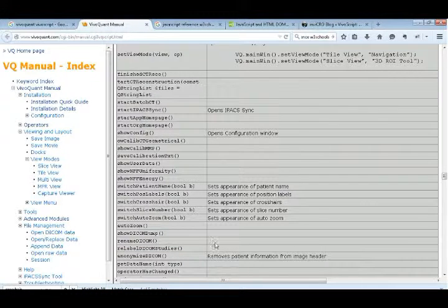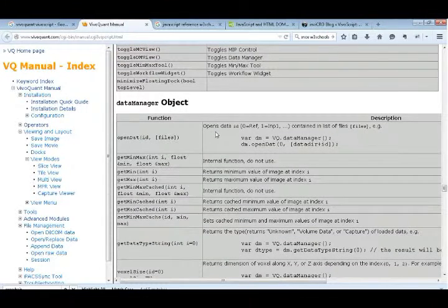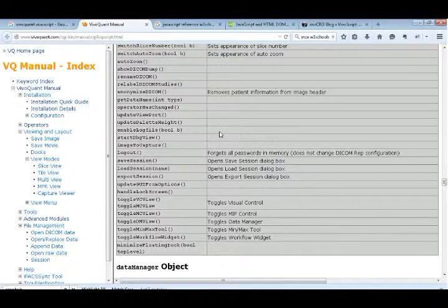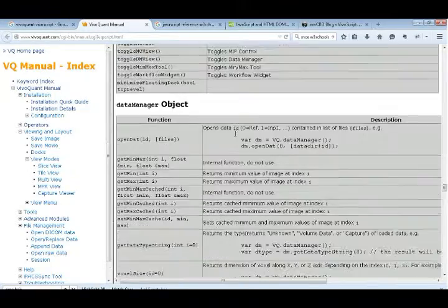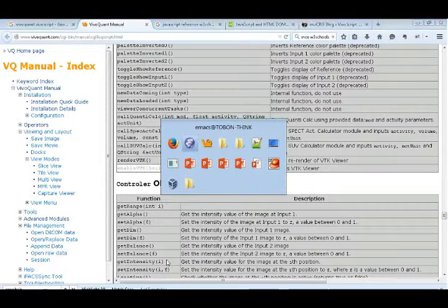Now if you are not familiar, there's the VTK and the classic MIP viewer to be able to project your data in a volumetric way into slightly different views. They each have their advantages, and I look forward to streamlining that a little bit in 3.0. But you can toggle between them using a function called enableVTK. You want to think of what owns that MIP viewer. I'm telling you that it's the slice viewer, but kind of intuitively, you know that the MIP shows up in the slice viewer, and indeed, if you get the slice viewer object, you're going to find an enableVTK function that toggles it on or off and switches between the two for you. So let me call it out in my script.